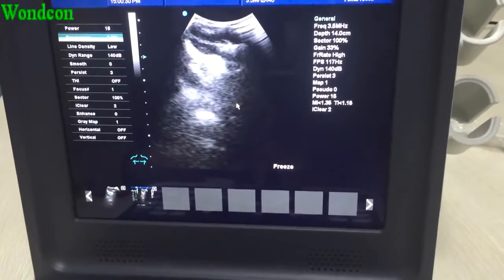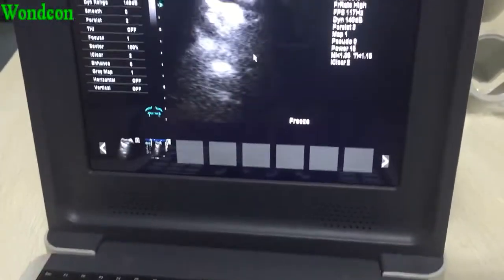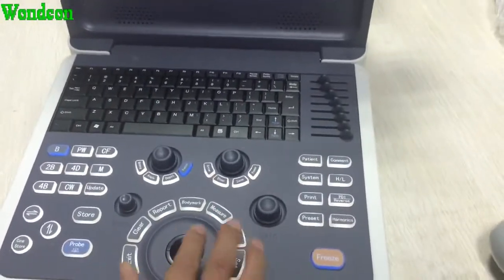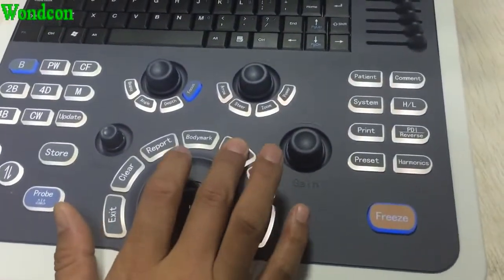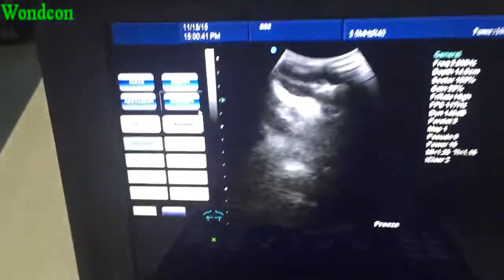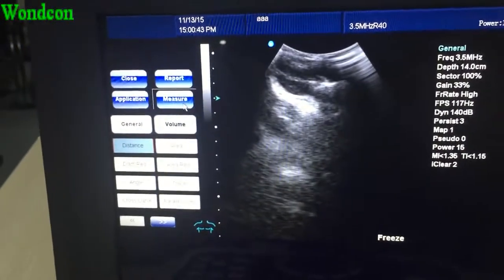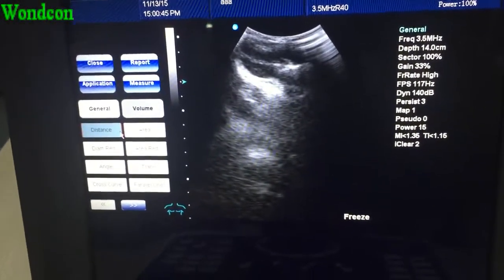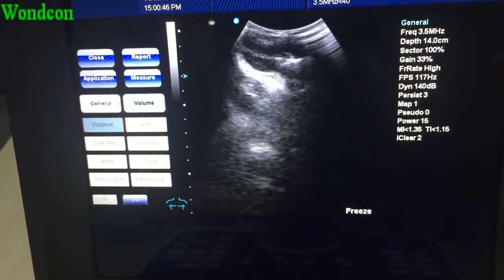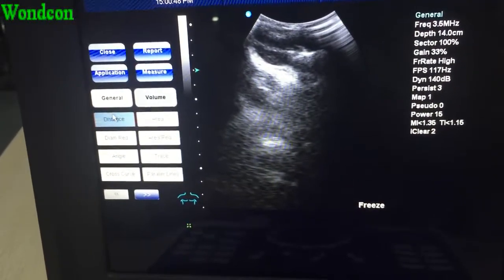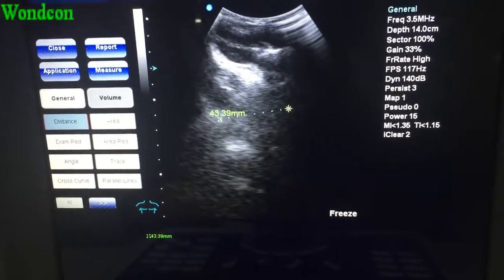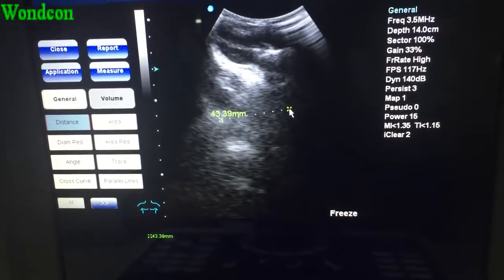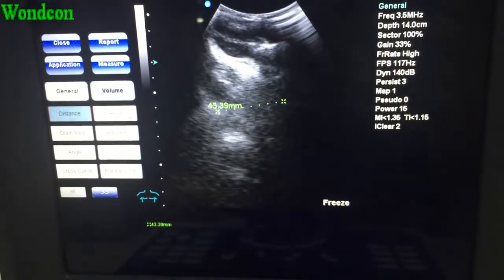Next, I will introduce you how to make a measurement. First, press measure. Here, choose such as the distance or the area.